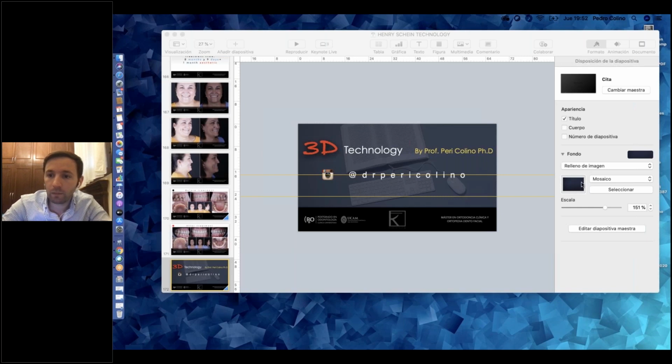Someone had a question here. When do you choose to check the airways on a class 2 case, or do you do CBCT as a standard protocol in your office? No, when I suspect an airway problem in a child or a transversal problem in a child, I decide to make a CBCT, not in all my patients, okay? For sure, when I decide to treat an adult and I suspect a dentoalveolar problem or transversal problem, I do it as well, okay? Perfect. More?